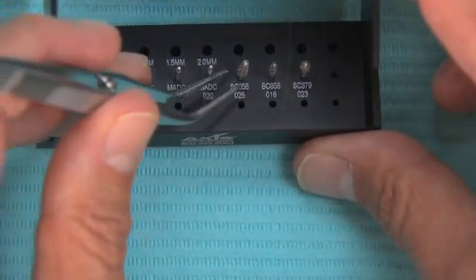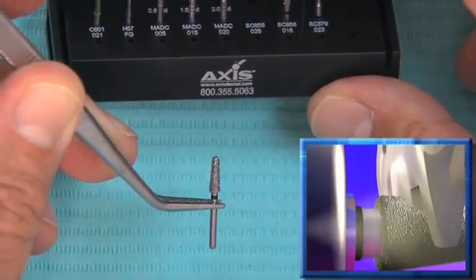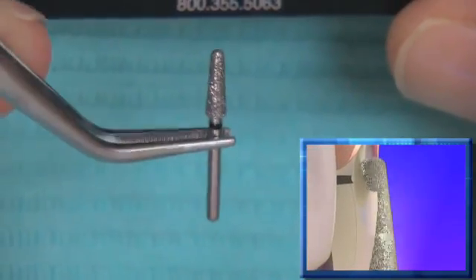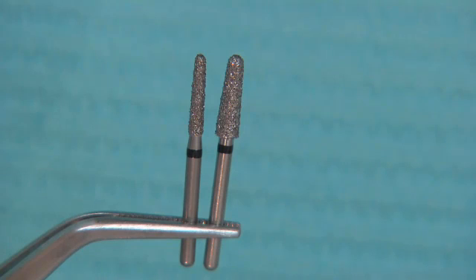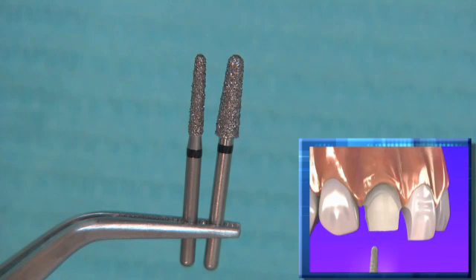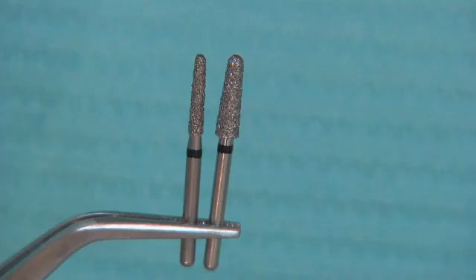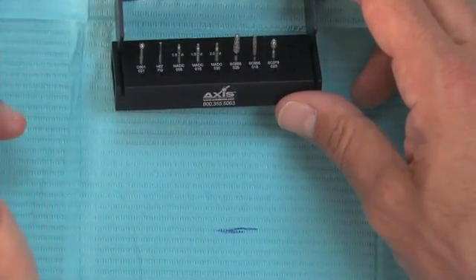The burr we do the majority of the work with is the 856025 super coarse grit burr. Once we've placed our depth cuts, it's a race to remove all the enamel off the tooth — this is our big workhorse burr, doing about 85% of the reduction. If we're prepping a single unit crown, it'll be tight interproximally, so we use a smaller version — an 856016, the same shape but skinnier — for the mesial and distal. Once we create additional space, we can take the 856025 all the way around the tooth, including interproximally.